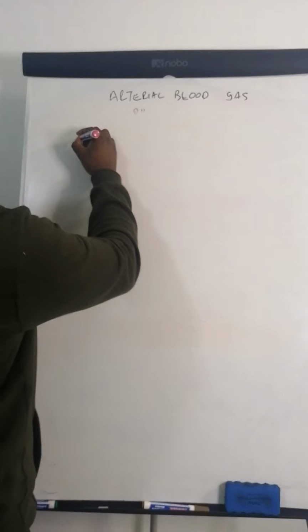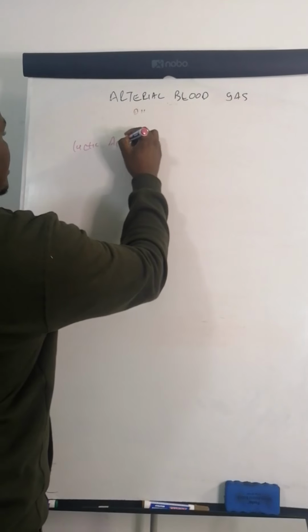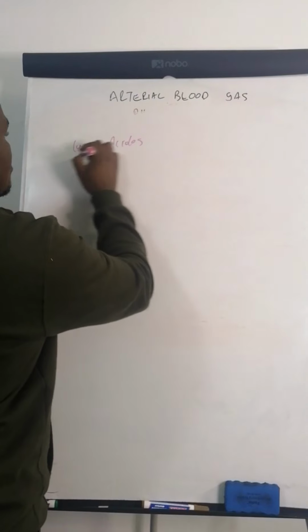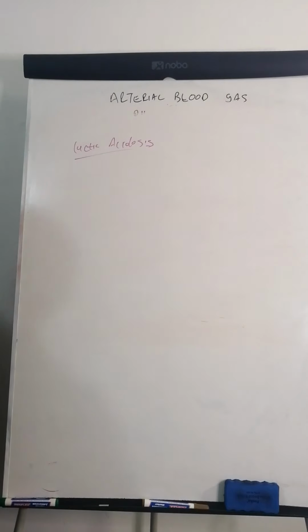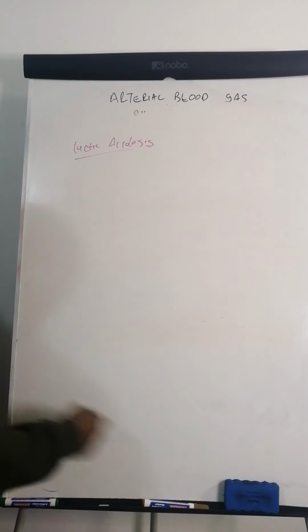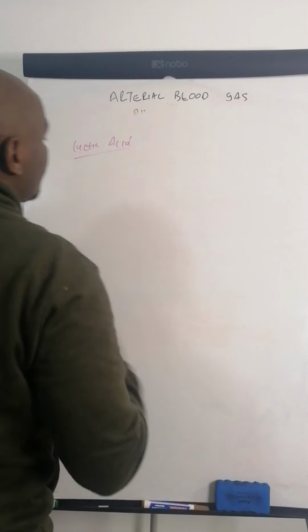When you look at an ABG, there is also a lactic acid value there.